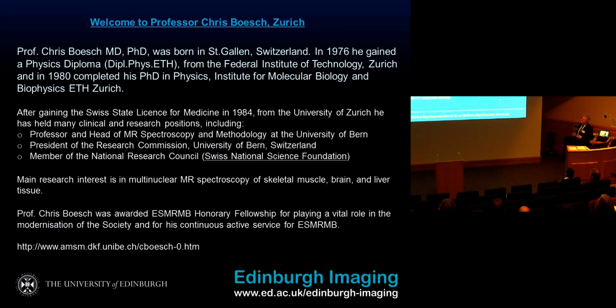However, that's not the only way how chemical shift can be used to identify metabolites. One of the very common ways is spectral identification in the images with a fat-water image or a Dixon or extended Dixon techniques, but also hyperpolarized spectroscopy, a most recent and very fascinating method. There we have either the spectra or the images of single metabolites for a very short time, but with an enormous sensitivity. At least for spectroscopy, it's an enormous sensitivity.